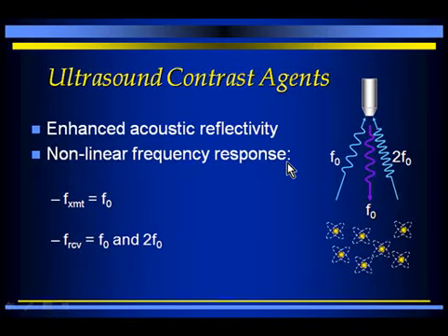Okay, so elastography is one method that has been described for looking for prostate cancer. That's still under investigation, and we're still awaiting the final analysis as to whether we can improve our distinction between cancers and normal tissue with elastography. Another technique, which is perhaps further down the road, is the use of ultrasound contrast agents.